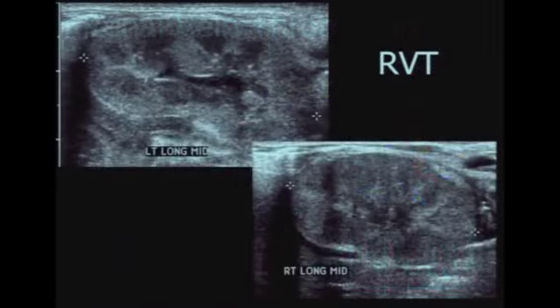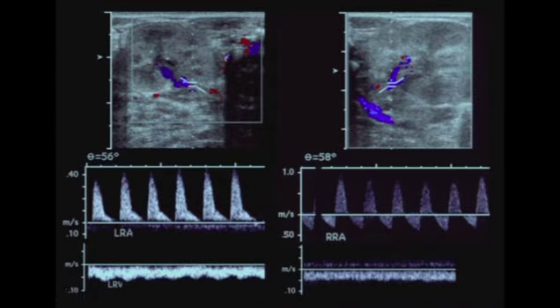So depending on when you happen to do the examination, you may not find the classic Doppler findings. So here's just over time, another patient, normal left-sided kidney, abnormal looking right kidney with poor corticomedullary differentiation, and again, similar findings with the Doppler evaluation. This is a neonate, so again, that would be low diastolic flow for you and I, but normal for this child. But again, look over at the affected kidney, very high intravascular impedance, reversal of diastolic flow.